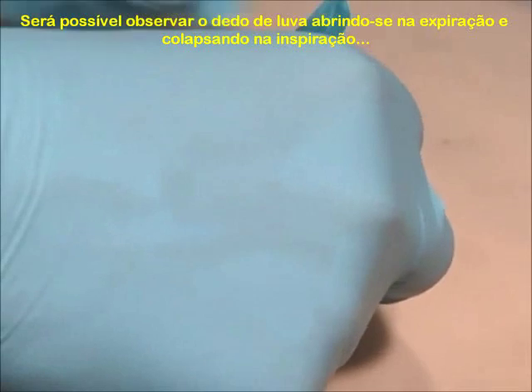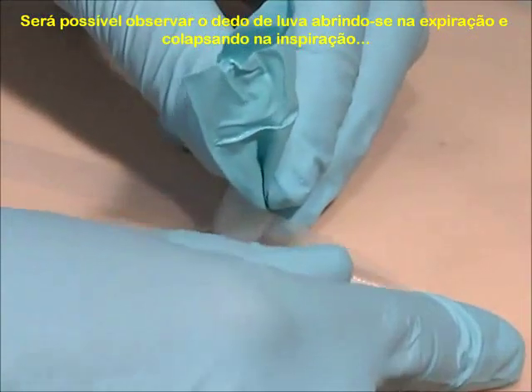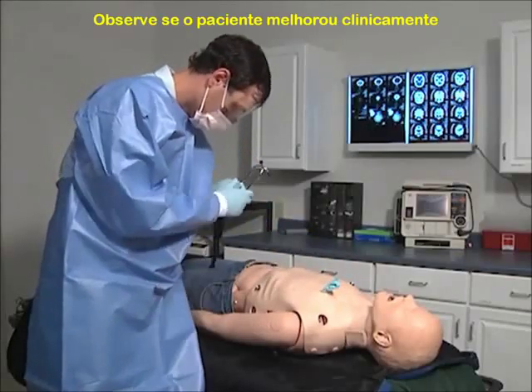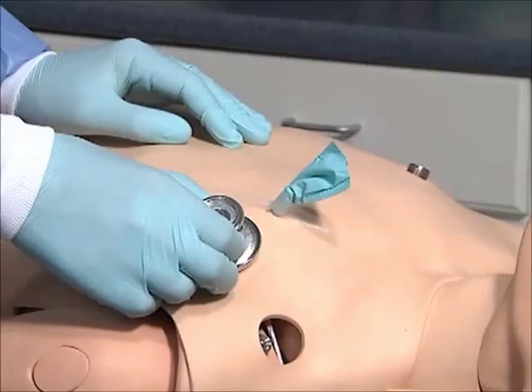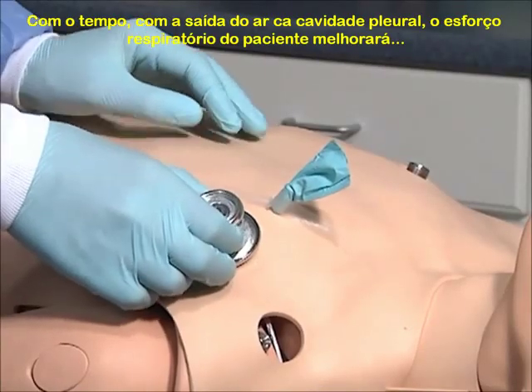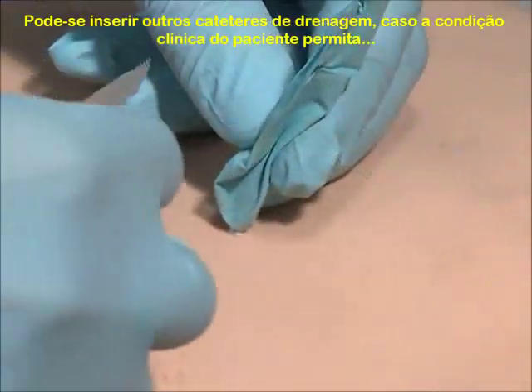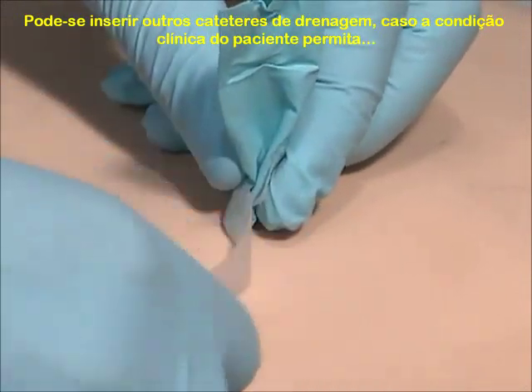You should note air escaping on exhalation and the glove finger collapsing on inhalation if your one-way valve is working correctly. Observe the patient for improvement. Over time, as air escapes from the thoracic cavity, the patient's respiratory efforts should improve. You may insert additional catheters to speed decompression if your patient's condition warrants.